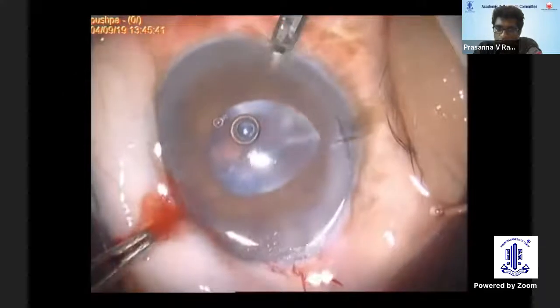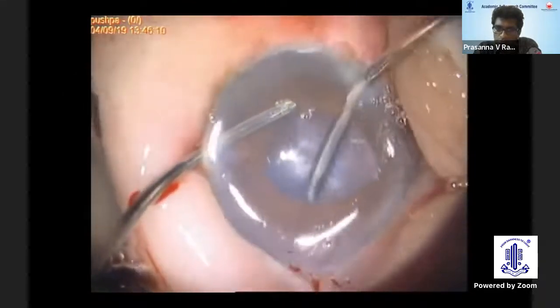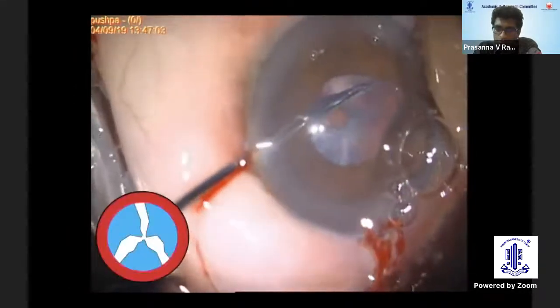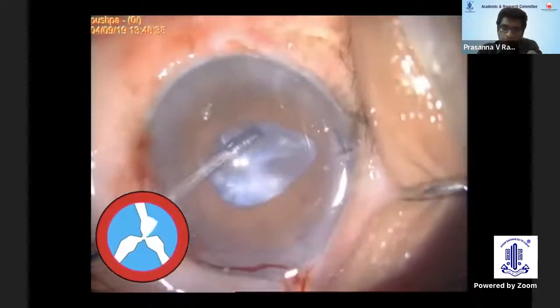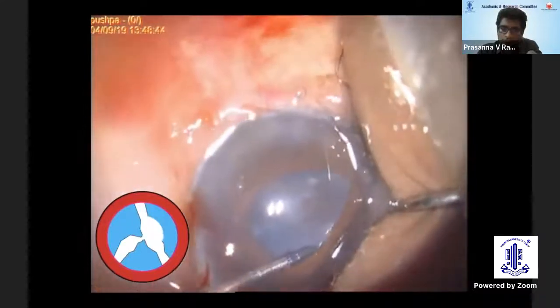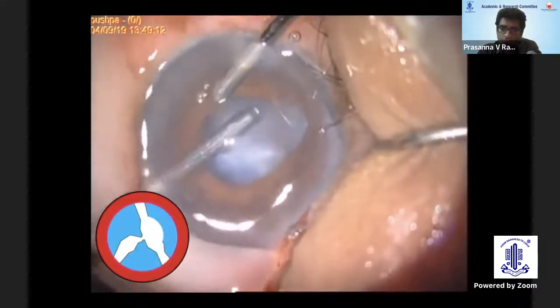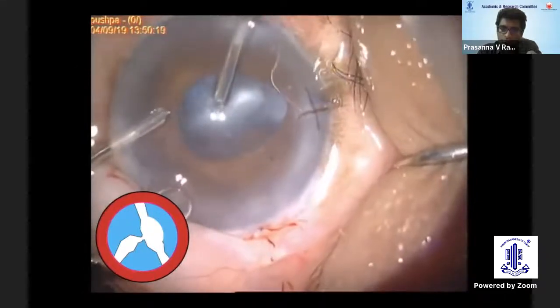Another paracentesis was placed for comfort of cortex aspiration. Mindful cortex aspiration was the key without capturing the remnant anterior lens capsule. There is a guided animation on the bottom left provided to depict the creation of a circular edge for one apex of the anterior capsular flap remnant followed by residual cortex aspiration. The idea was to try and create a circular axis with the 3 triangular flaps so that the IOL can be placed in the bag.